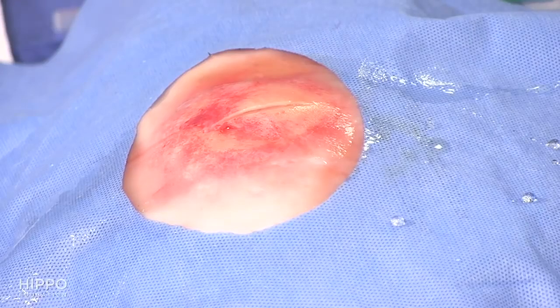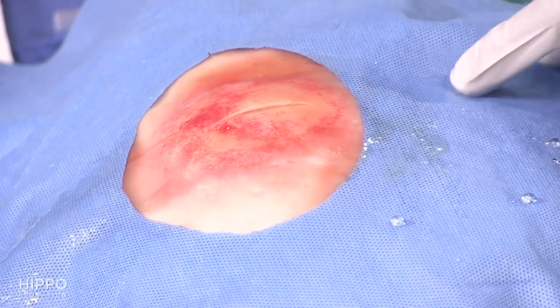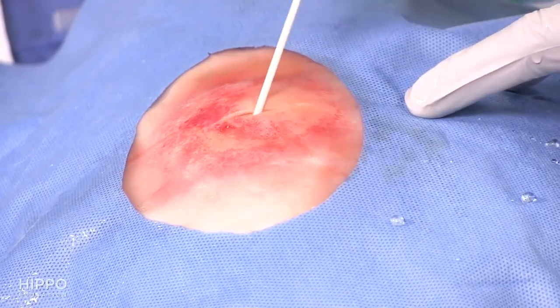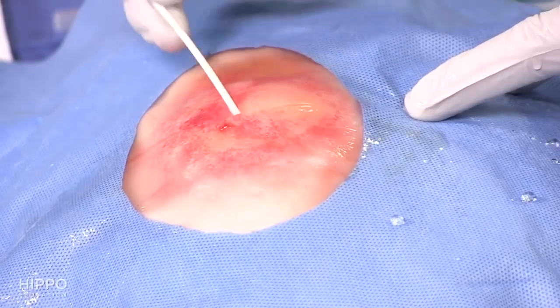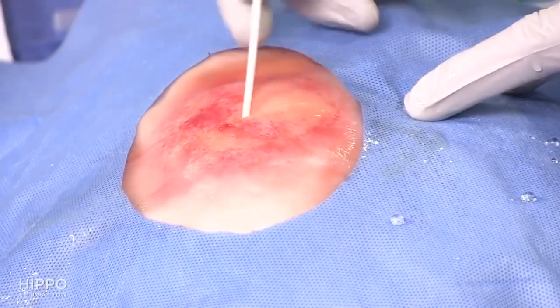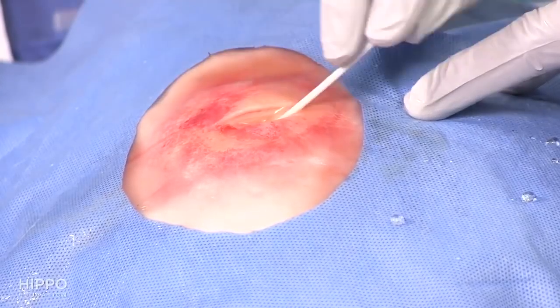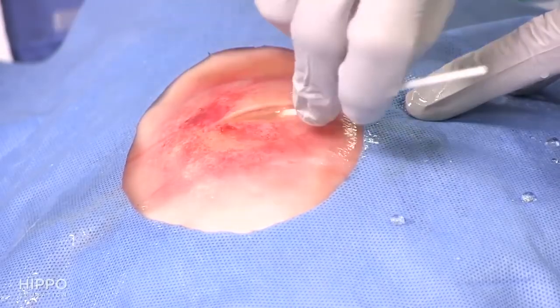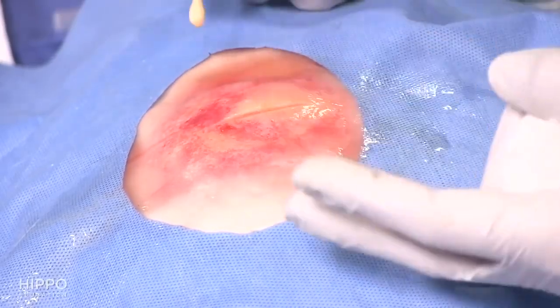After irrigation, I like to do one last check before packing — using a cotton-tip applicator or blunt forceps to go back in and feel for any residual pockets that still need to be drained. Feel along the edges of the abscess for deeper tracks. If you're not getting significant purulent material and there are no deeper pockets, you're ready to pack.